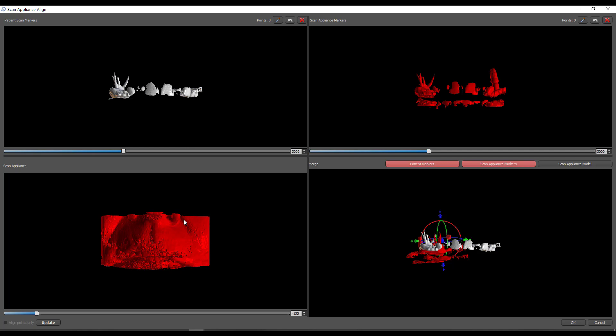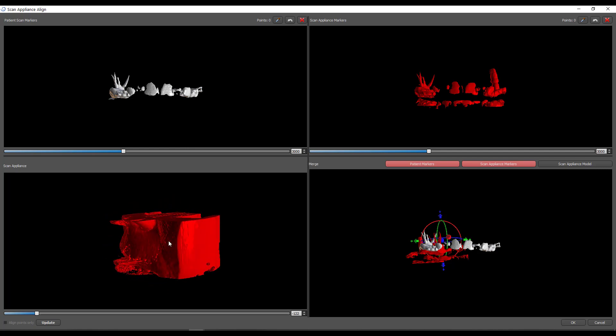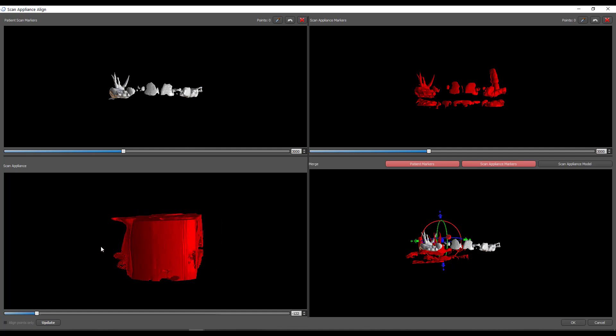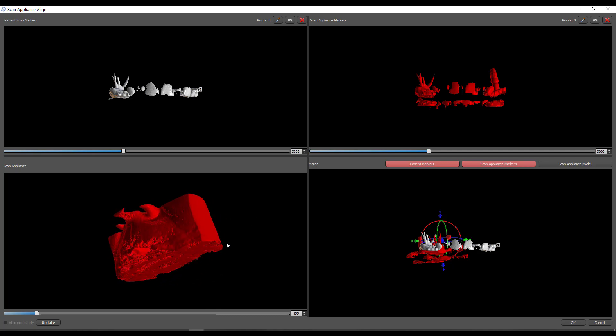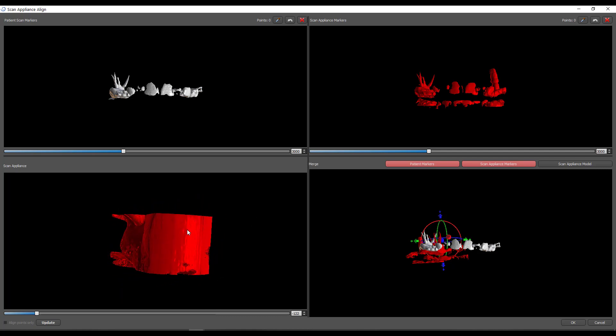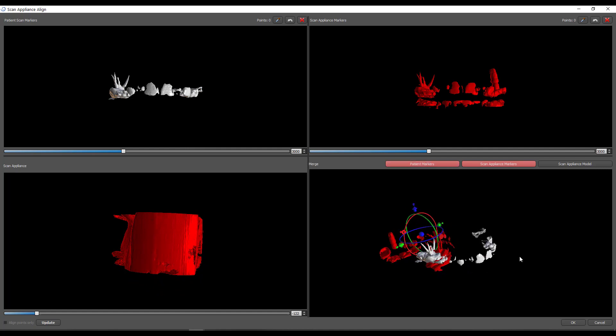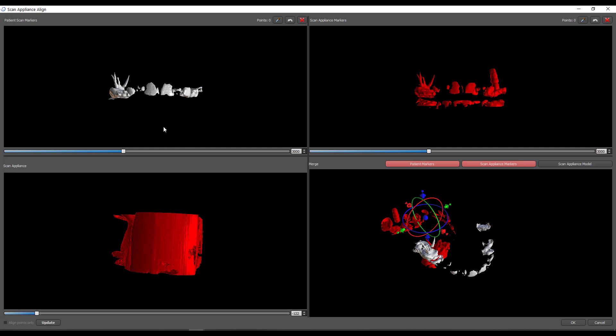So here we go. So again, this is typically for use in pulling in a denture with radiographic markers. You would have the patient wearing it in one scan, and then the denture alone in the other scan. So you've got to think about when you're telling it it's a scan appliance that you're importing, what it's trying to do here is it's trying to reduce the density in both of these top windows such that mainly just radiographic markers show up. And then what would typically happen in the bottom left is that this should look like just a full 3D volume rendering of that denture. And that way it would stitch based on the points, it would match everything up, and then you would be good. Now, obviously, this is not a scan appliance, and we're, again, hacking this. And so you should notice that you've got some sliders under here, and you've got the ability to put in values for this.